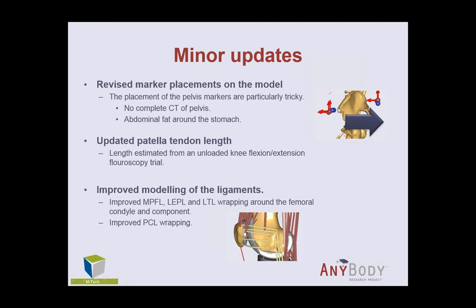In the beginning, we had placed the bone kind of in the middle. So we had assumed that this offset was on both sides, so it's completely symmetric. But this is probably not true for this patient, so we moved the pelvis back a bit so that it had more of an offset towards the anterior side.